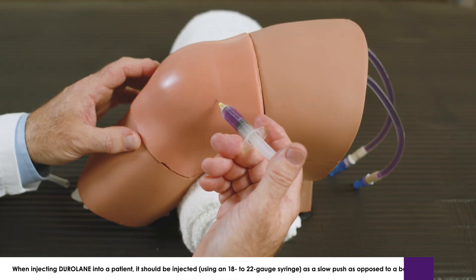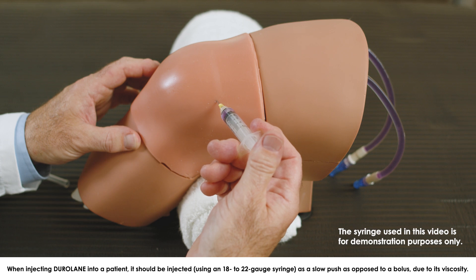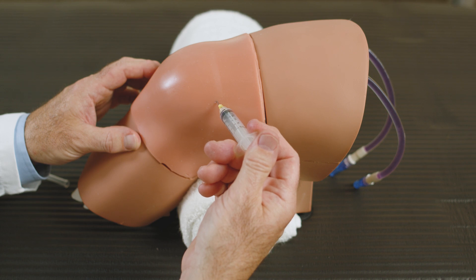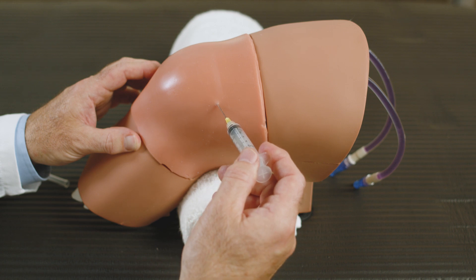When injecting Duralane, you would keep the needle in the joint space, detach the arthrocentesis syringe, and attach the Duralane syringe. Duralane, due to its viscosity, should be injected as a slow push as opposed to a bolus. That way, should you come across any resistance such as a synovial fold, you can reposition the needle slightly and continue to inject.